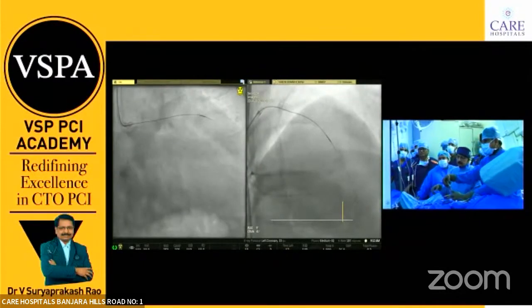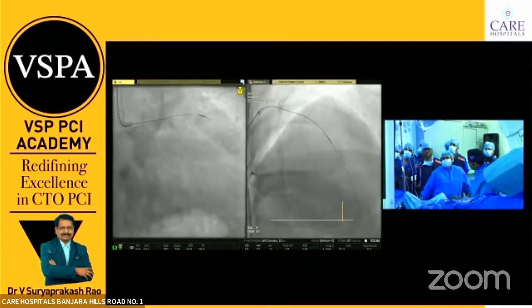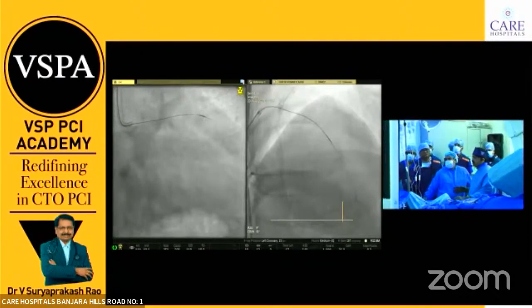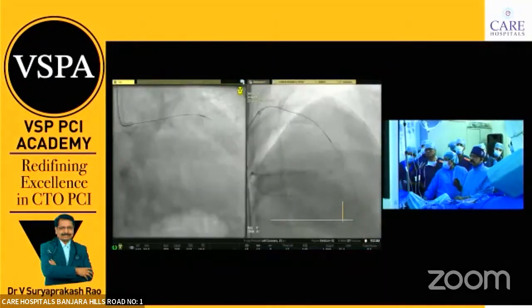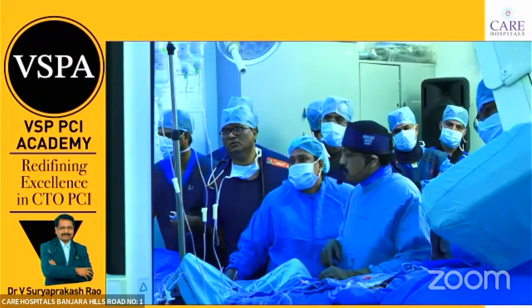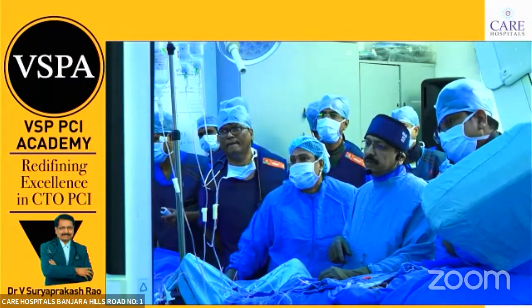See, okay, fine. Now we see this is the secret. You call it a 2D wiring. I call it a 2D wiring. Mathematically, 3D wiring is different. Ideally, you can say this can be a 2D wiring. You magnify and show. We have to see whether we are in the right track.